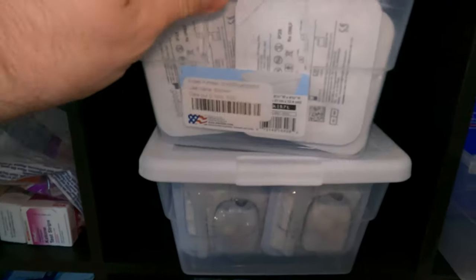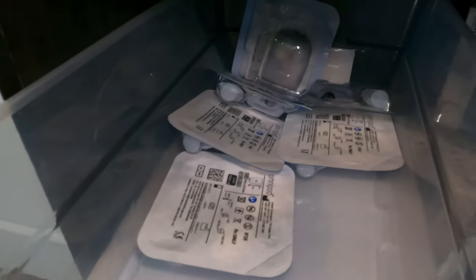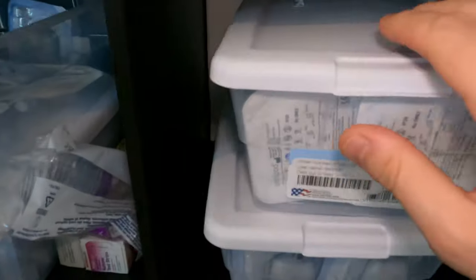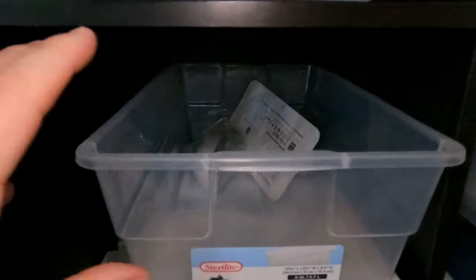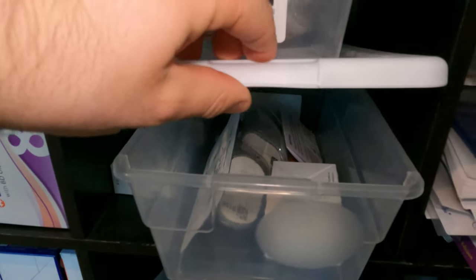These here are my two totes of Omnipods, with this one being almost empty. What I'll do is take this one out, exchange it with the full one, and move the empty one over — that's the rotation process we use. We also have a Dexcom cubicle: my daughter's stuff is on the bottom and my stuff is on top. As you can see, I have two left and my daughter has three — she just got hers.